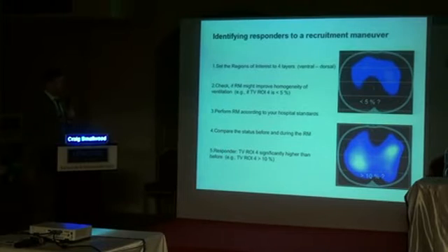And this is actually data from one of our subjects, and we performed a recruitment maneuver. This patient obviously responded because they've had a marked increase in overall ventilation, but in particular ventilation in region of interest 4, we're getting some ventilation down there.